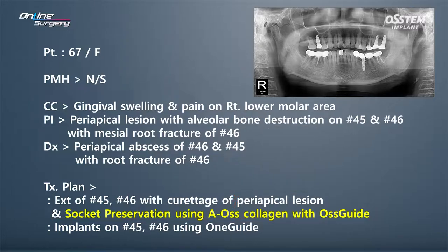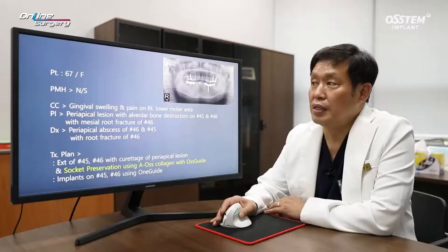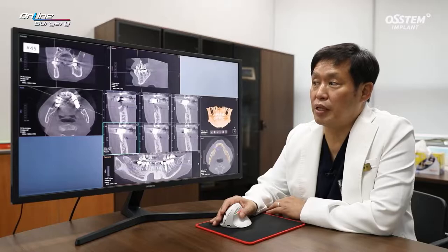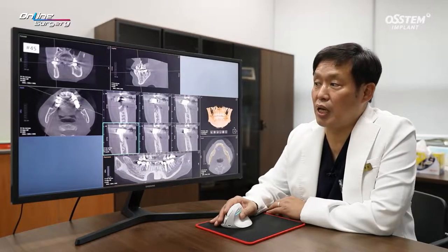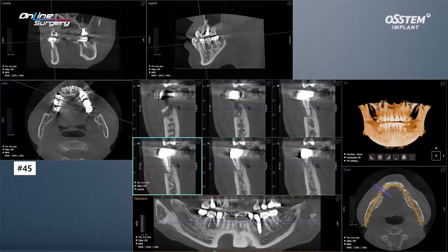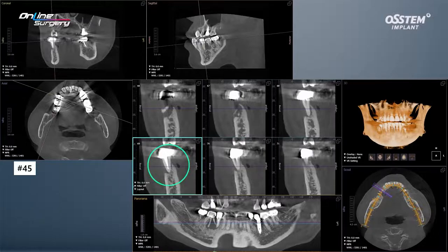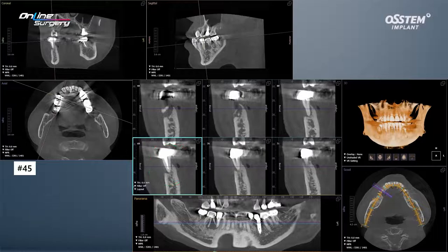Four months or later, one guide will be used to place implants in numbers 45 and 46. Looking at the CT at initial visit in number 45, along with the apical lesion, you can see that the buccal bone is completely resorbed.